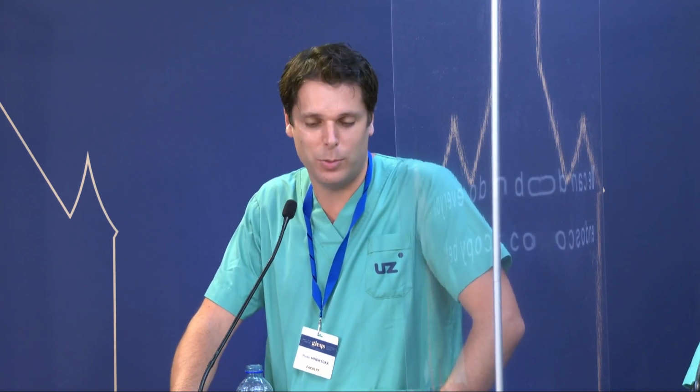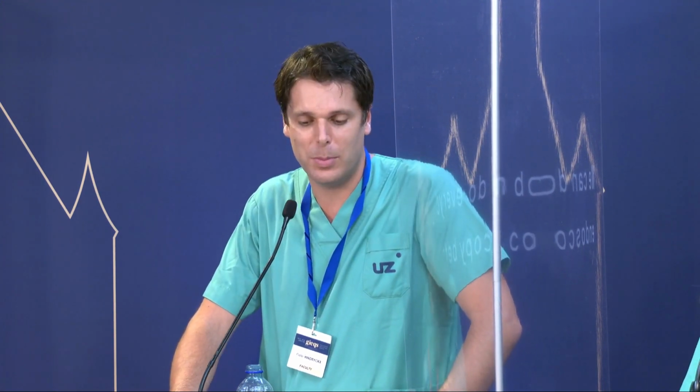Well, as of my personal experience, colonic stenting is technically the most challenging procedure. Or the most dangerous procedure, I would say, because you can easily have a false route with the wire. So we do them not very often, but I think this is the most challenging stenting procedure that you can perform.